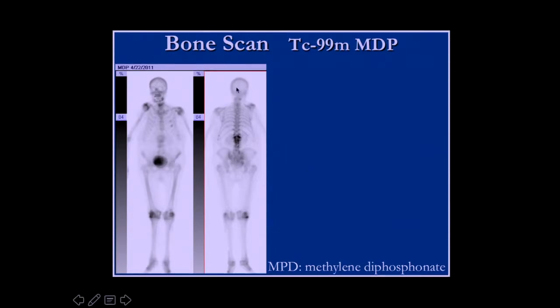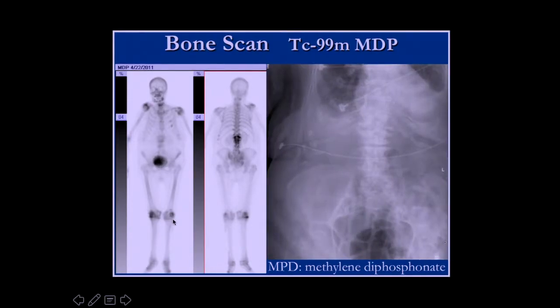So a bone scan is here, and it's not too hard to figure out. Top of the head, this black area is really high activity, urinary bladder, some of it is excreted. Shoulders look like they hurt, as do the knees. Take an x-ray of that, and this whiter area is where there's more bone stopping the x-ray beam. So this patient has bad degenerative disease in her spine.